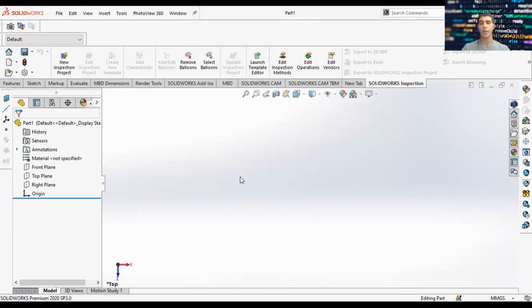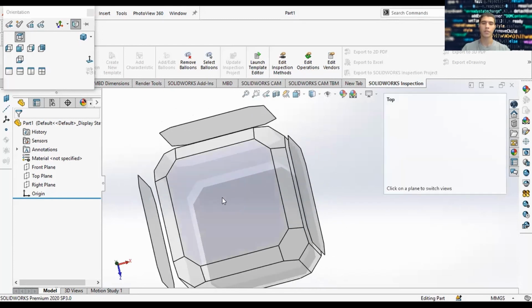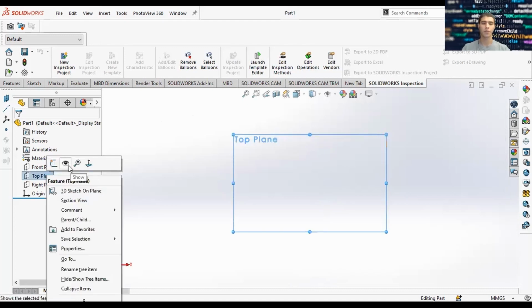And you can press spacebar on your keyboard to get this cube for the different orientations. So we're going to start at the top orientation, and we're going to show our top plane.